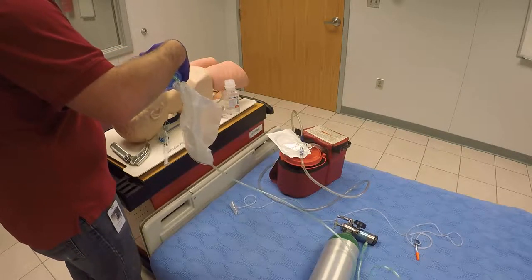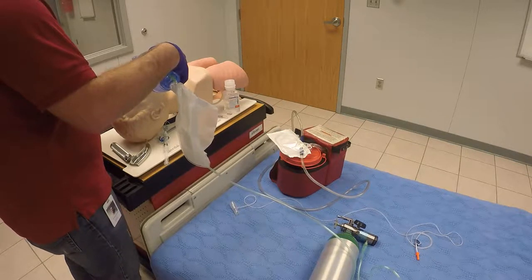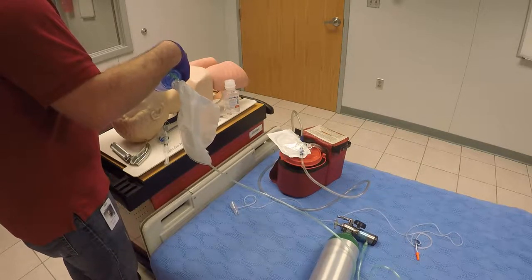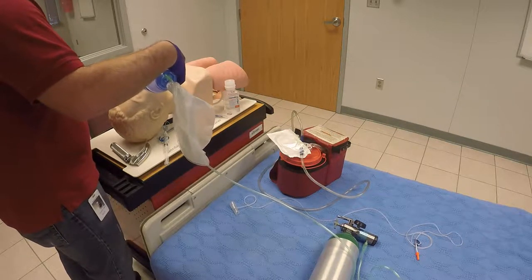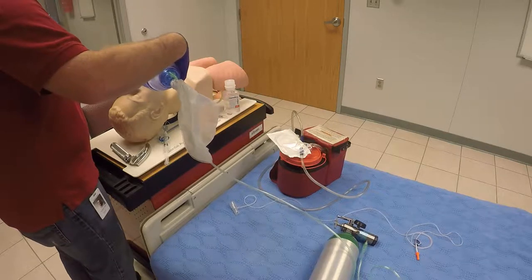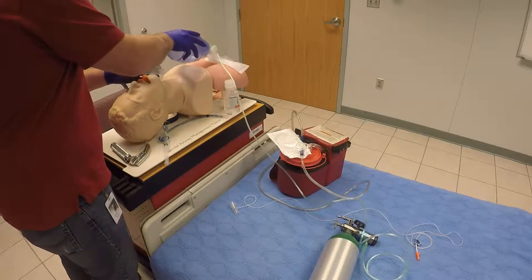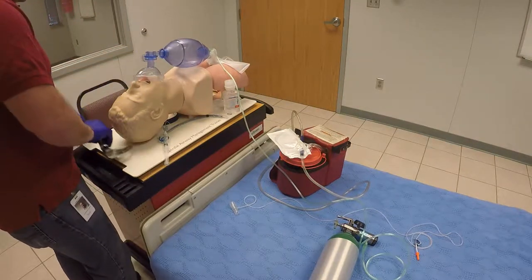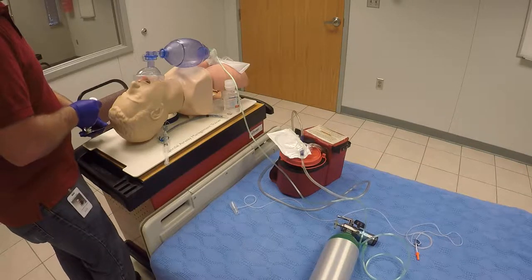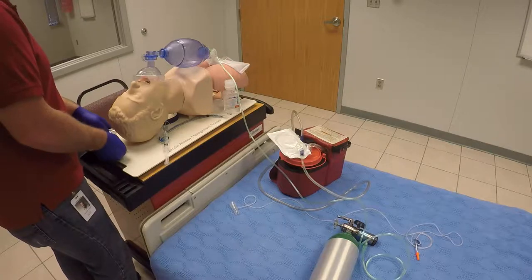At this time I'm going to attach my SPO2 monitor to the patient and begin monitoring that reading, trying to obtain an SPO2 greater than 95%. I'm going to let my partner take over pre-oxygenating the patient while I get all my equipment ready. Pre-oxygenating at a rate of 10 to 12 breaths per minute, maintaining that SPO2 rating greater than 95%.